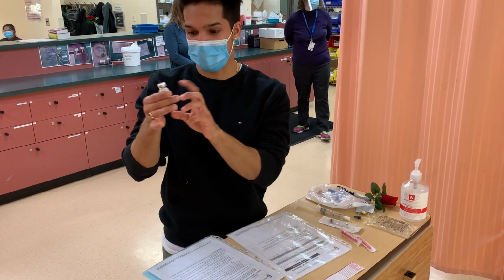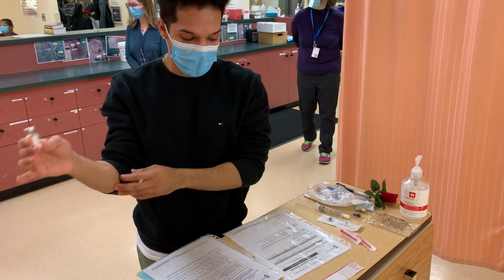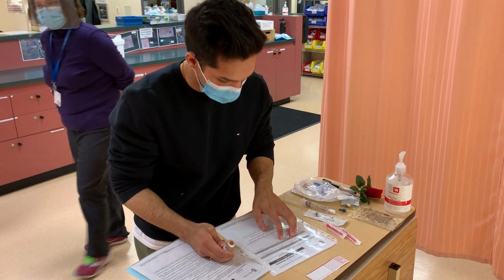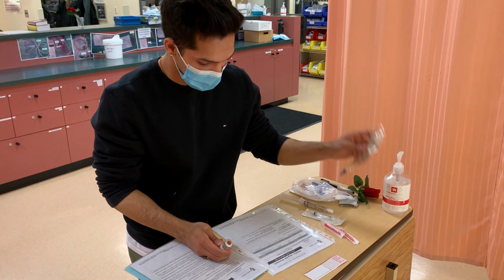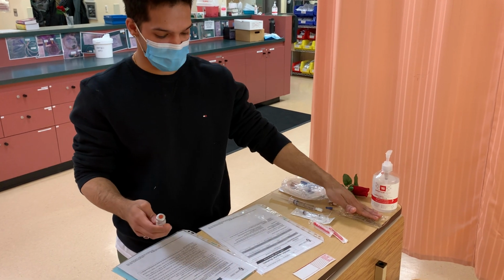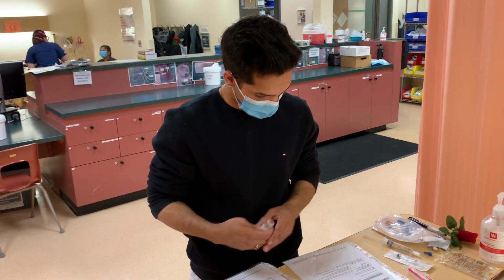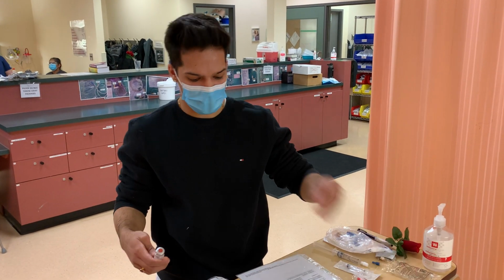which is equivalent to 1 ml from this vial. So this vial comes in 100 units per ml, so I'll be using 1 ml from this vial, adding that to a 100 ml bag of normal saline, which is right here. And then the final concentration of the bag will be 0.99 units per ml, and the final volume in the bag will be 101 mLs.